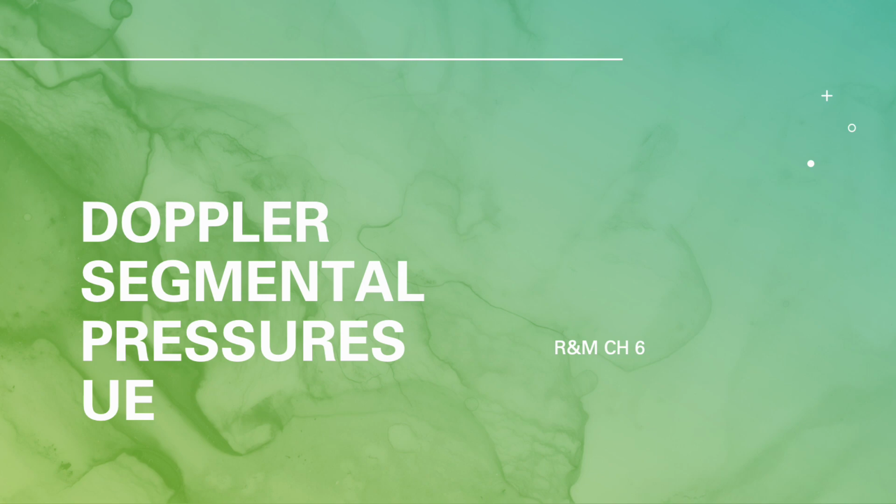Now we're going to go over Chapter 6 in R&M, Doppler segmental pressures of the upper extremity. This is the same as our lower extremity on the legs with the arterial machine with the blood pressure cuffs. We'll just do it on the upper extremities, on the arms and fingers.